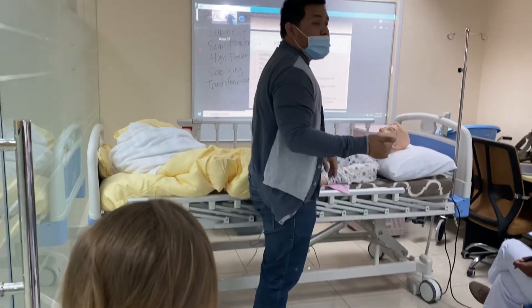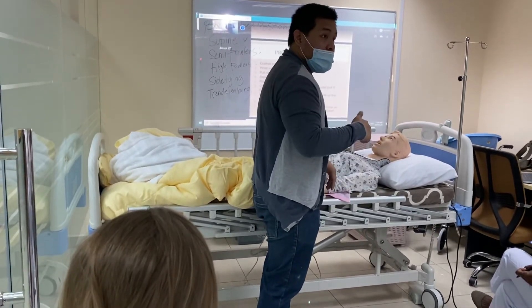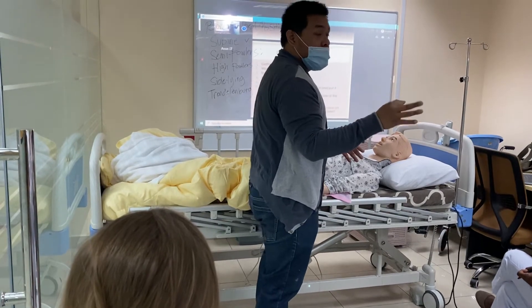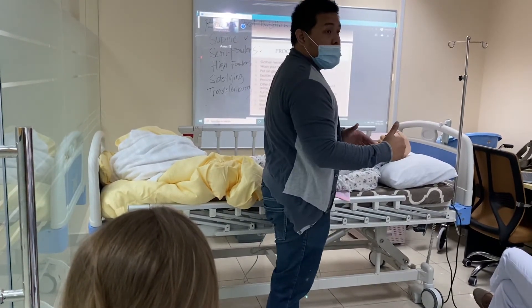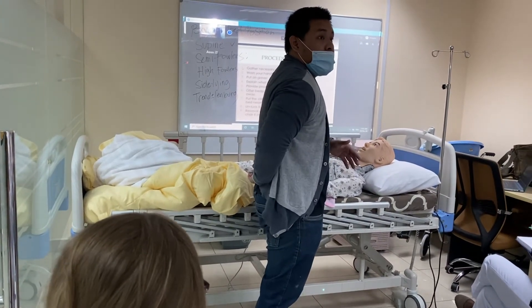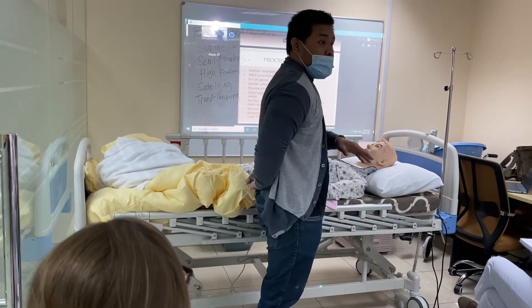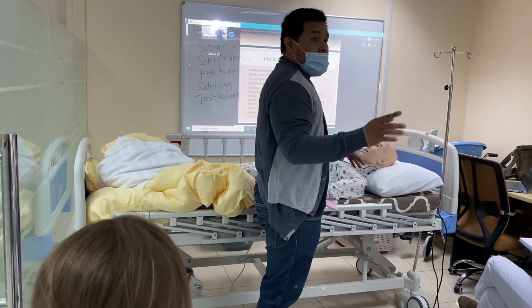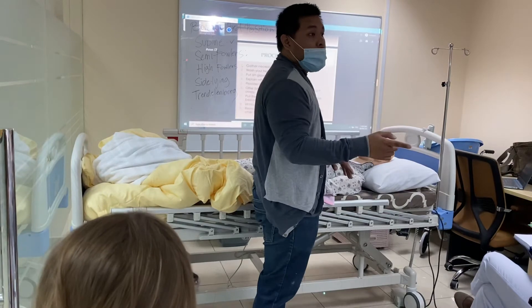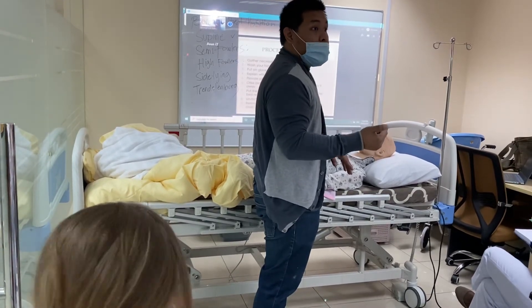In moving a client, if you're going to pull them in the bed, always divide their body into three different parts. Do not pull them all at once — it will be difficult and it will put strain on your back. I want you to try this, since most of you chose to use a partner — a human being, not a mannequin — so you will be able to feel the actual weight of a human person.